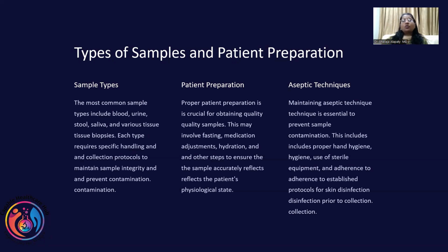So there are so many instances where the patient should come prepared. Then aseptic techniques, especially blood culture. I have seen numerous instances. We have our skin microorganisms, then we use a toilet, we are in the hospital, we touch this, we touch that. And of course, on the patient's body, it will all be there. And if we do not use aseptic techniques, the blood culture grows something which is not in the patient's body.